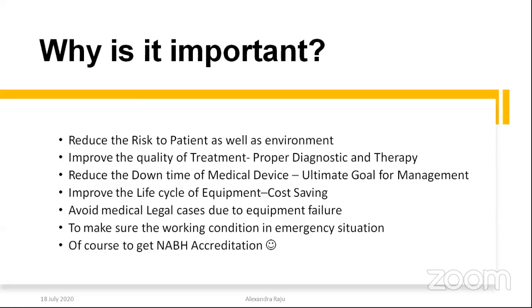To make sure of the working condition in emergency situations, for example, nowadays ventilators are mainly used for COVID patients, and ventilators are widely used in hospitals. So we have to ensure that the working condition is accurate, that the ventilators are delivering the fixed values or not. We have to ensure the correct working condition.